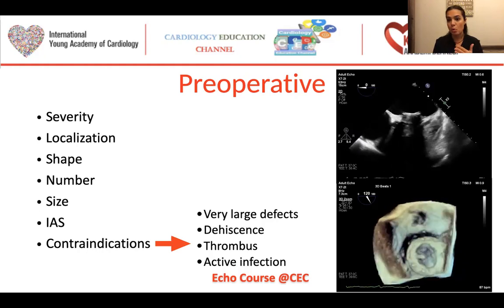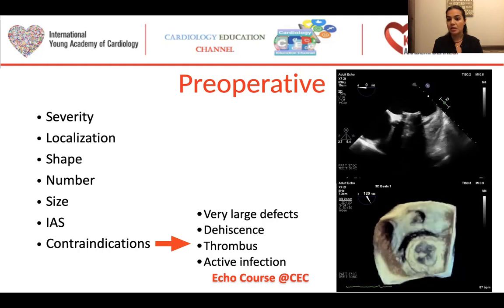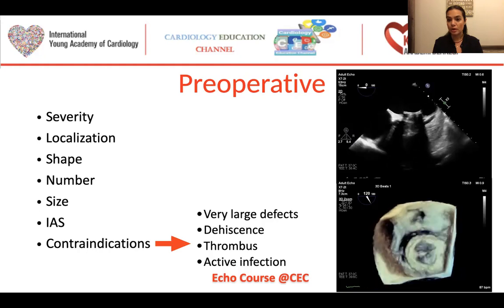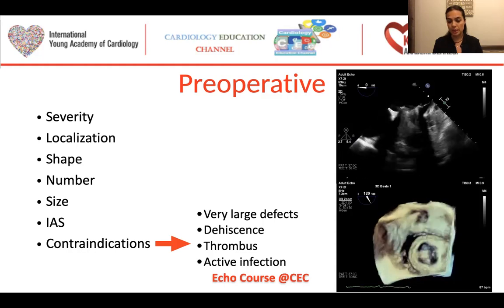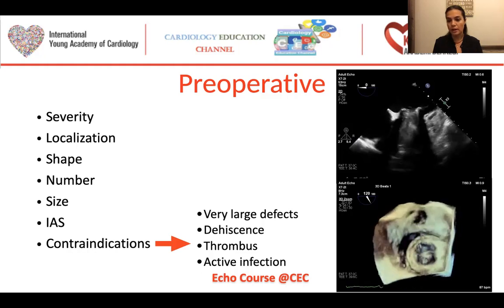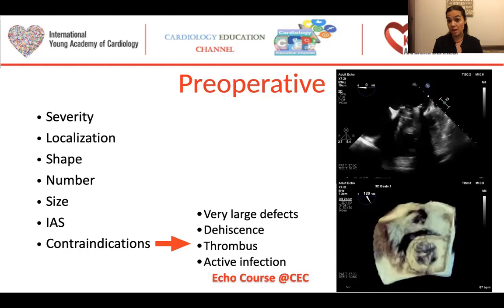It's so mobile, and we can easily see the swinging suture on the wall. And in 3D images, we can see that nearly half, maybe more than half, of the prosthesis is just detached.